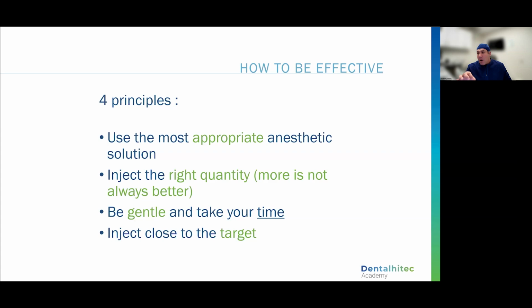When it comes to quantity, I want everyone to remember that sometimes less is more. If we are giving higher volumes of local anesthetic than are needed, sometimes that's actually not a good thing. But I will tell you that you should be finding you're using far less local anesthetic with an intraosseous technique than you are with a standard block, okay?